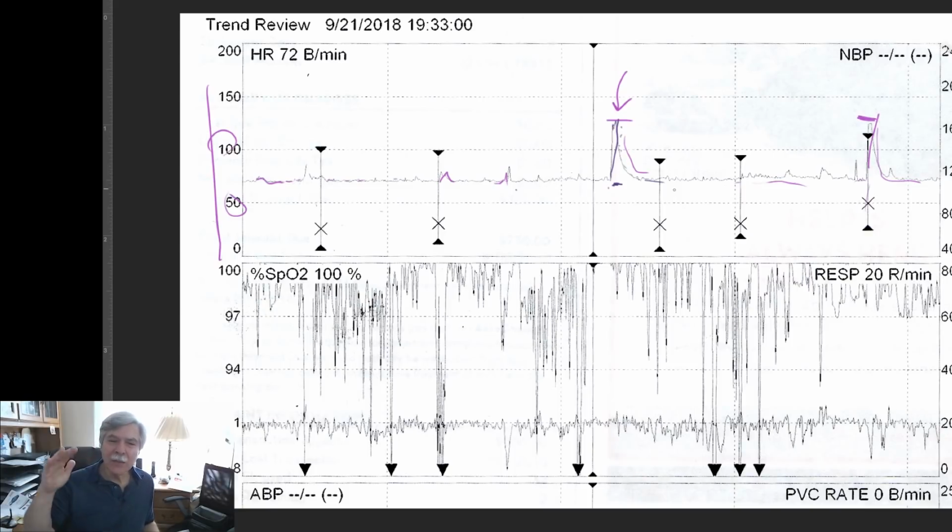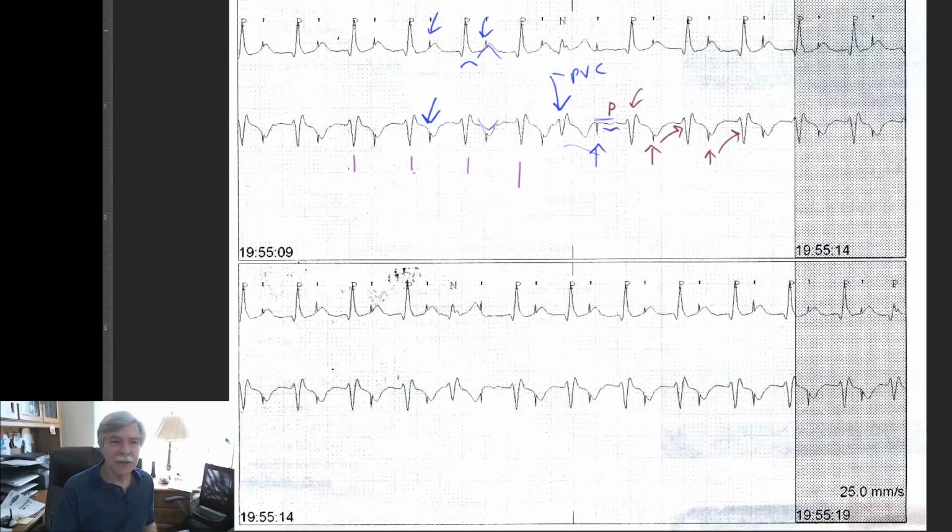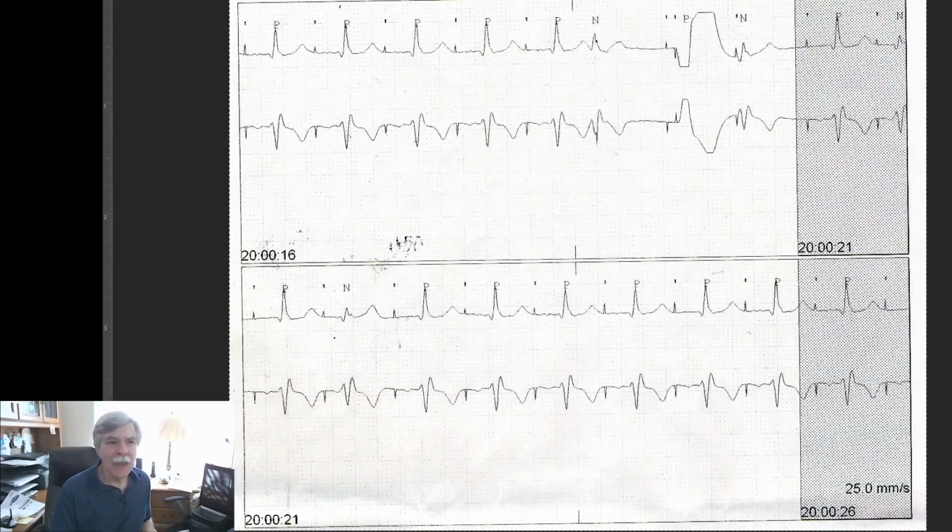The physical movement of the bed was activating the pacemaker's rate adaptive pacing circuit and driving the pacemaker to the upper sensor limit, the upper rate limit of the sensor. So what it was doing is this, and then when you look at the trend coming back down, here's the next one. You can see that it's still atrial pacing here at a rate of about 90 beats per minute, but it's gradually coming back down.